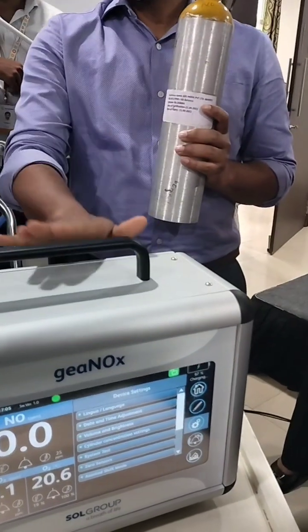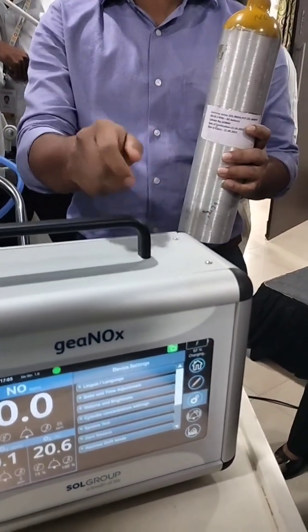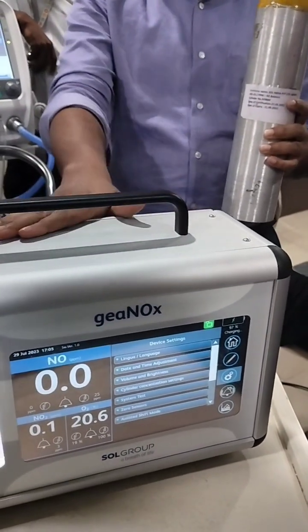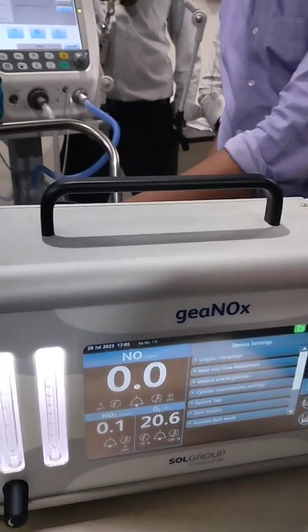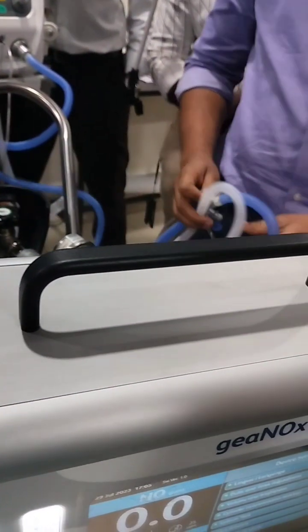They calibrate the cells inside — the NO cell is calibrated this way, and the oxygen cell will calibrate by default on its own. That is the routine for the calibration part. Up to this point, this is the inspiratory part, and this section is connected to the iNO delivery system on the inspiratory side, then it goes to the baby.